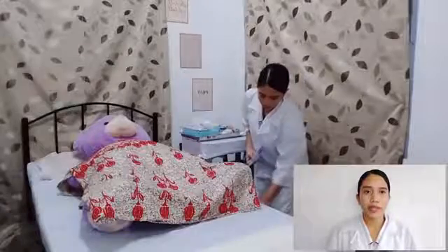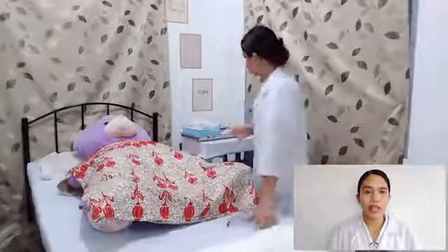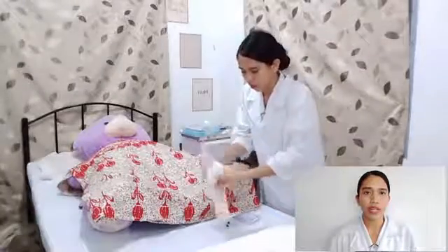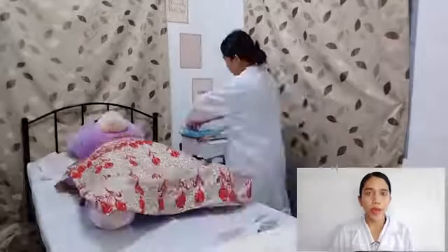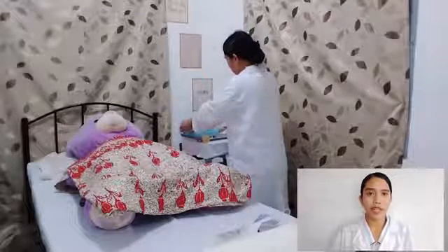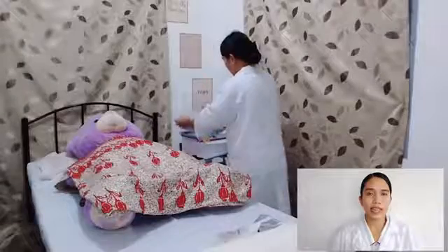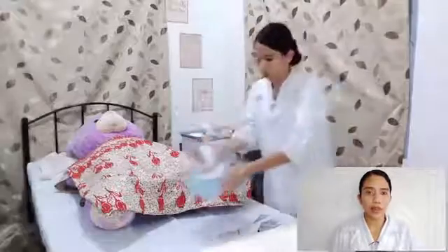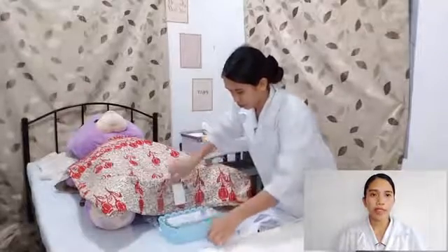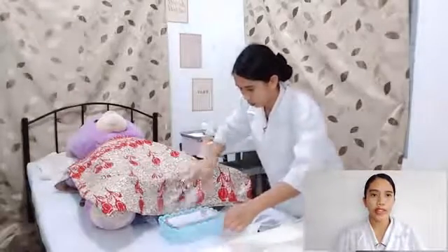Prepare the urine receptacle and tubing if an indwelling catheter is to be inserted. The tubing facilitates connecting the catheter to the drainage system. Open the pack and bring it near the perineal area. Placement of the equipment near the worksite increases efficiency. Observe aseptic technique. Sterile technique protects the client and prevents the spread of microorganisms.